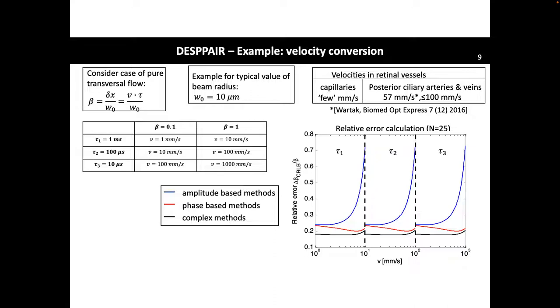I don't have it. I have it in my next slide. Anyway, so what I can do now is I have these 25 measurements, and I can fit the best likelihood. But also from the best likelihood fit, I can determine my accuracy. If I change my beta a little bit, will it still fit nicely? If it still fits nicely for large changes in beta, then I have a large relative error on my measurement. And I can do that for the individual components.